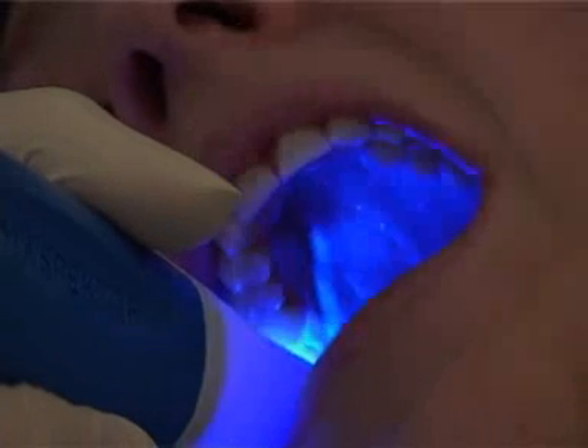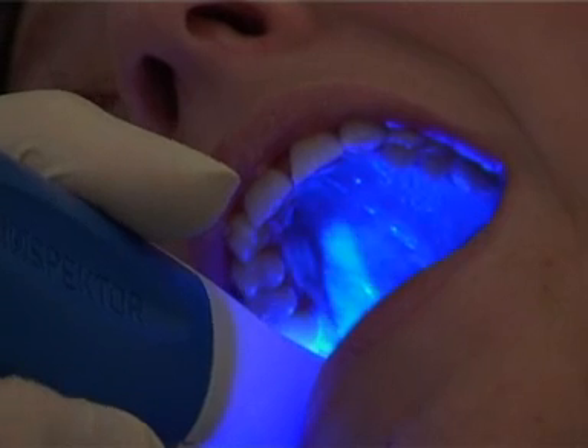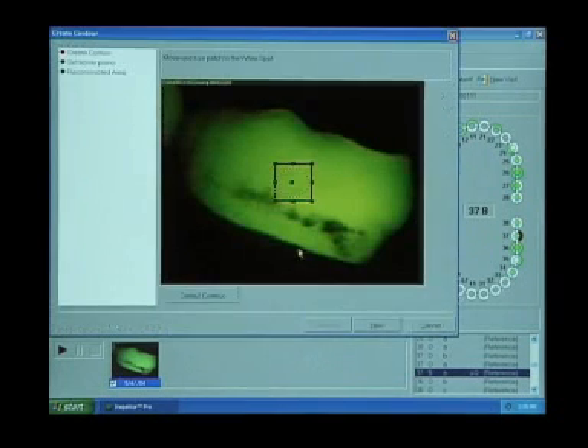Intense but harmless blue light comes from the Inspector Pro handpiece to illuminate the teeth. This blue light is transformed by the organic matrix of the tooth tissue into green fluorescence, which is captured by the camera in the handpiece. The illuminating blue light is removed by a yellow filter in front of the camera, leaving only the green fluorescence — resulting in the QLF image displayed on the PC monitor.